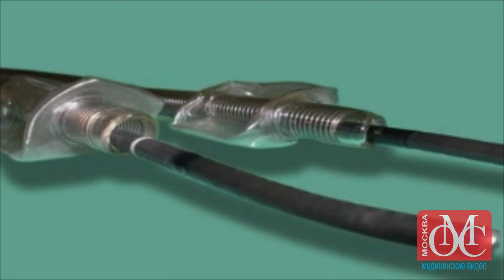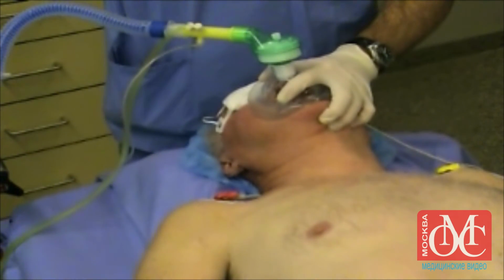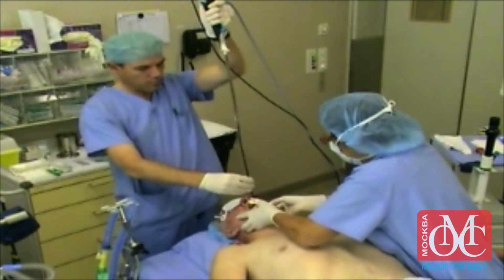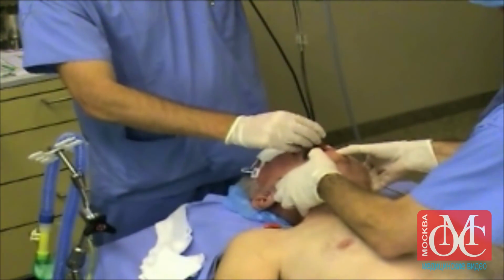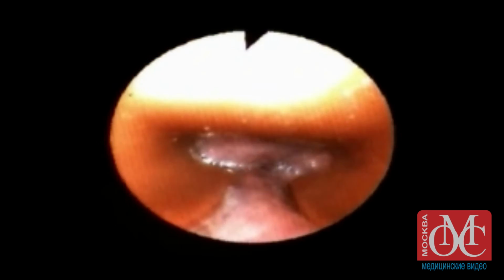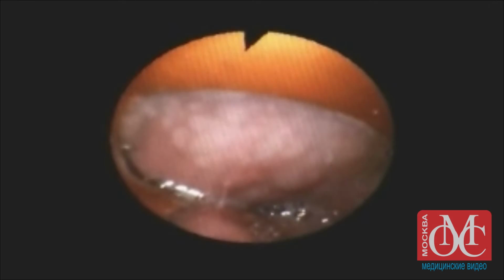It is very important to minimize the gap between the tube and the fiberscope, since a small gap decreases the likelihood of difficulty when advancing the tube over the fiberscope, especially in the posterior arytenoid region. When performing oral fiberoptic intubation, be sure that the chin lift and jaw thrust maneuver is adequate and be certain that the slit oral airway is the right size. In general, for adults a number 4 slit airway is the appropriate size. If the oral airway is too large, it will obstruct your view through the fiberscope as you advance towards the glottis.